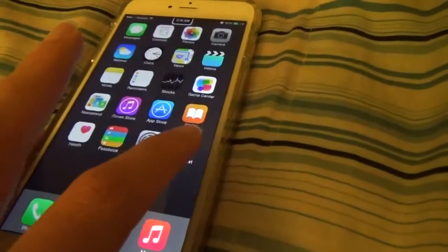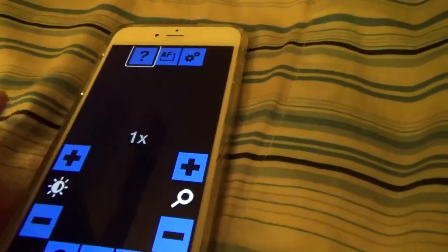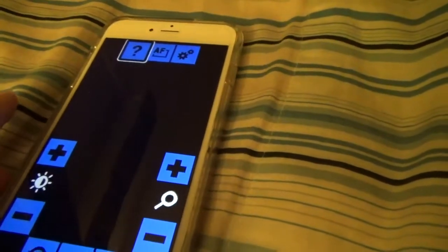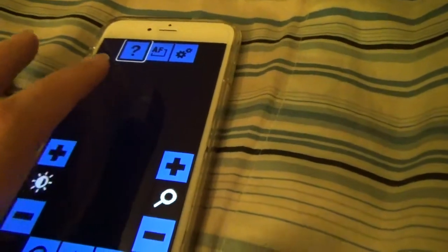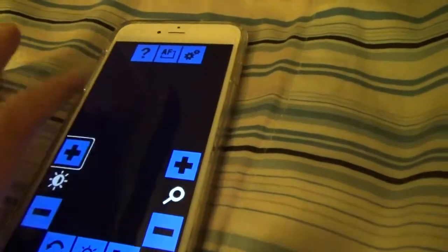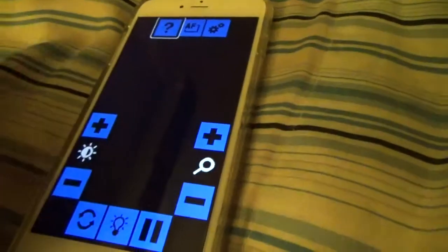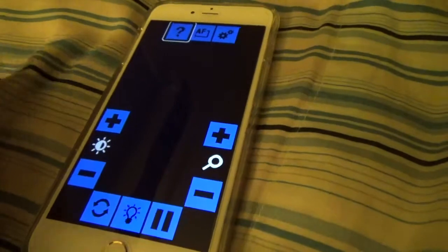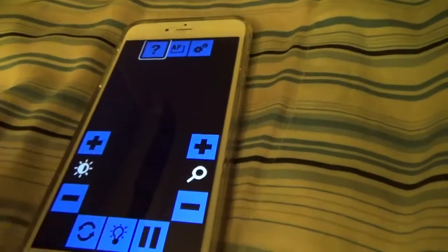So let's go ahead and activate Vision Assist, which for those of you who can see, it's the little white background with the eye on it. Vision Assist. Double tap to open. Vision Assist. Help button. Show a help page. Hang on, let me have it read that again. Increase contrast button. Settings button. Toggle autofocus. Help button. Show a help page. Okay, so you notice that VoiceOver went ahead and read a help tag for what each button does.